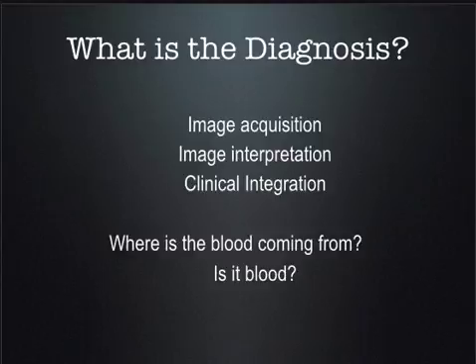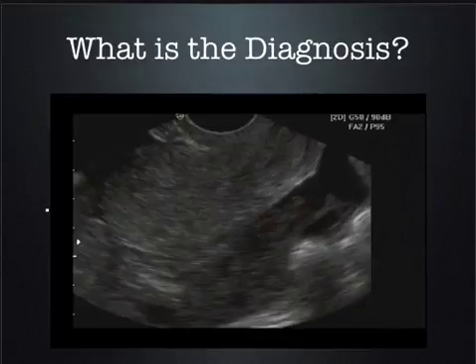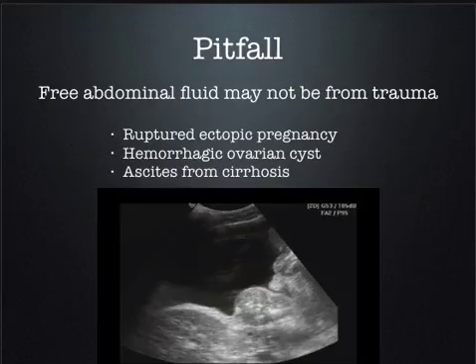So I tell you, hey, this patient is pregnant. This is a young, healthy female. She's pregnant. You do an ultrasound, a transvaginal ultrasound, which we'll be doing later in the year, about February, March, sometime in there. We're going to learn transvaginal ultrasound. This is all free fluid in the pelvis. It's actually blood. You can tell it's blood, and clotted blood at that. And then there's an ectopic pregnancy on here somewhere, but you've got free fluid, free blood, it's over there, free blood in a healthy young female, and it's up in the right upper quadrant, and her pregnancy test is positive. She has a ruptured ectopic pregnancy.